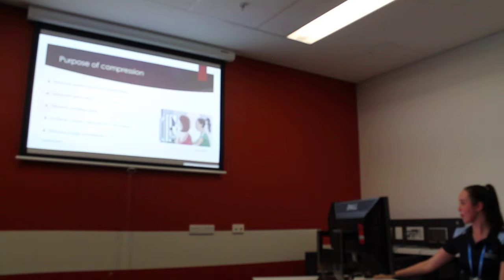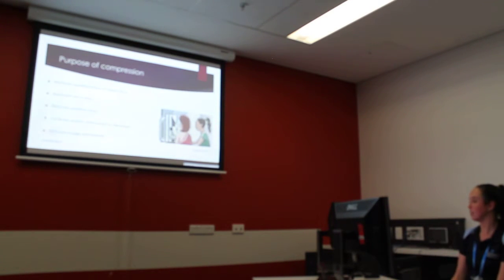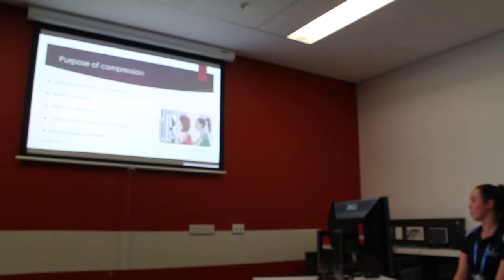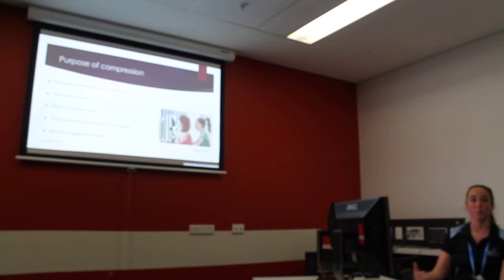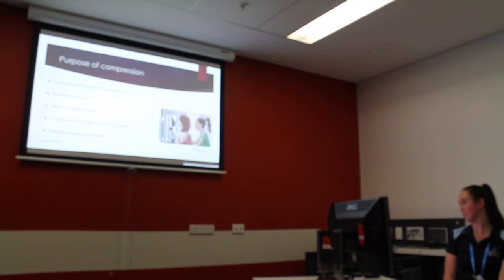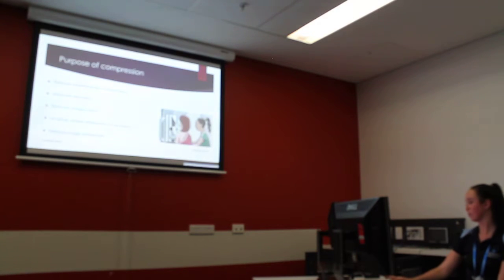breathing. So the mammography unit utilised at the Robina campus has an OP dose selection, and this allows for high subject contrast and reduced dose, whilst using a tungsten and rhodium anode filter combination. However, a minimum of 30 newtons of force is required. So again, not all patients can withstand this. However, some patients can withstand up to 70 to 80 newtons of force. It's really dependent on them. However, if less than 30 newtons of force of compression is applied, the AEC or a manual exposure should be set, depending on what's most appropriate.